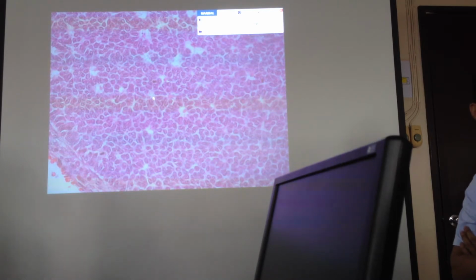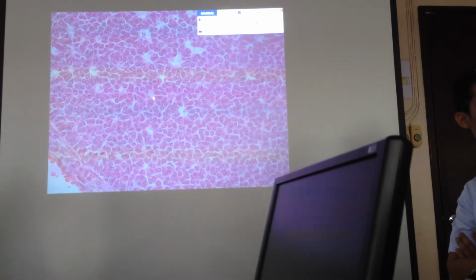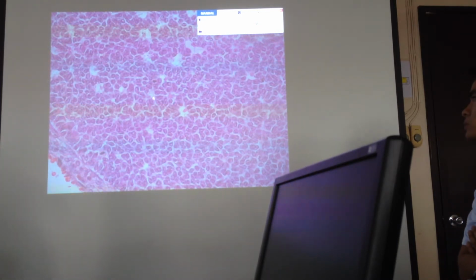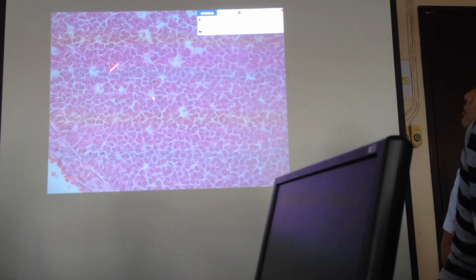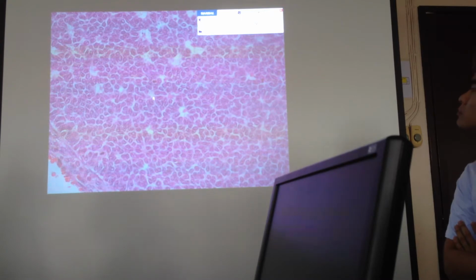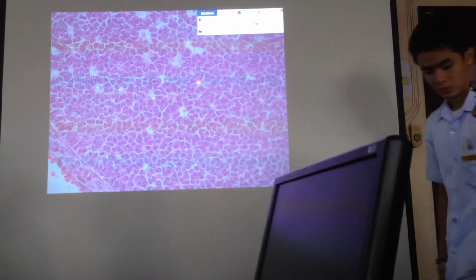Okay. So, when you say granulosa cell tumor, okay, pag sinabi niya Call-Exner body, that's consistent with granulosa cell. Okay? Walang ibang tumor sa ovary na merong Call-Exner body. Okay? It's the only one. So, when you say Call-Exner, you will see them in follicles. Call-Exner bodies. Okay? And then, very characteristic also of the granulosa cell.